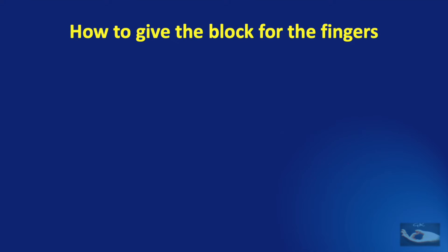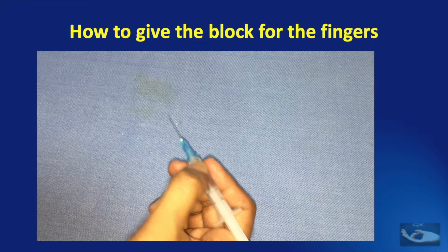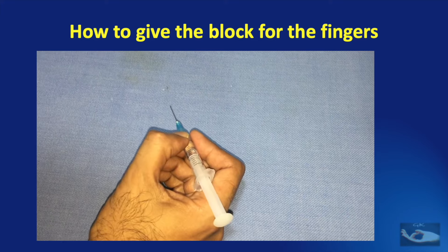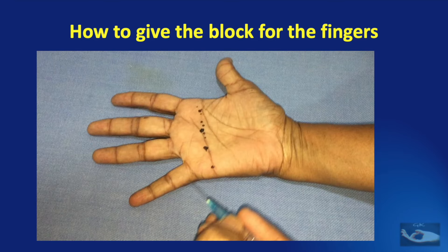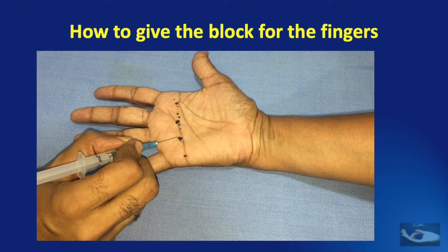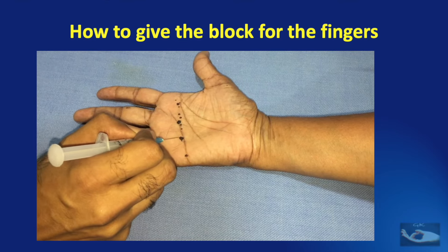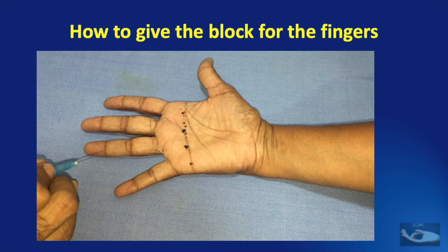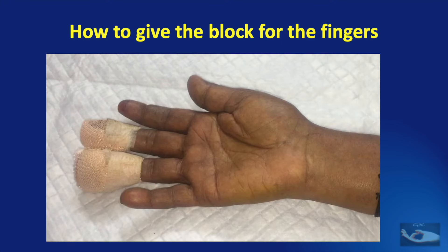We shall now see how the digital block is given for the fingers. After loading the drug, hold the loaded syringe like how you would hold a pen. The digital block for the fingers should be given along the distal palmar crease at two points for each finger. For example, for the ring finger, it will be at the points proximal to the web space between the middle and ring, and the ring and little fingers. We shall now see a demonstration of the finger digital block being given for the middle and ring fingers for this patient, whose wounds have been examined and a preliminary dressing applied. A digital block is going to be given for the two fingers before the dressings are removed and the surgery is done.